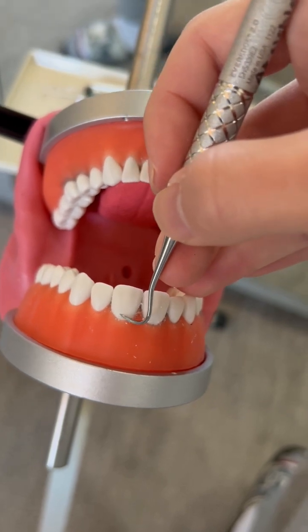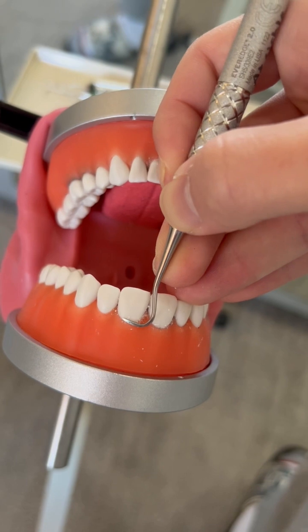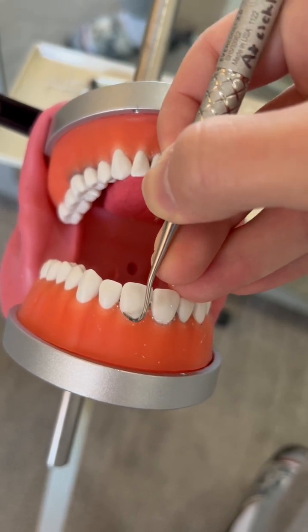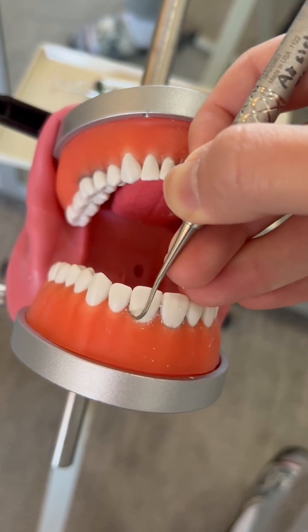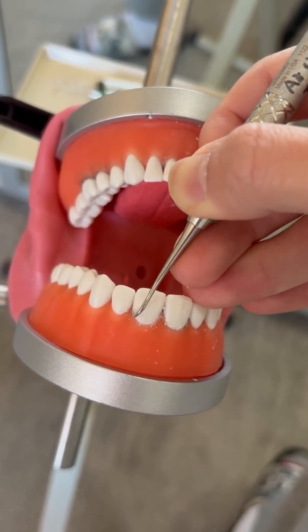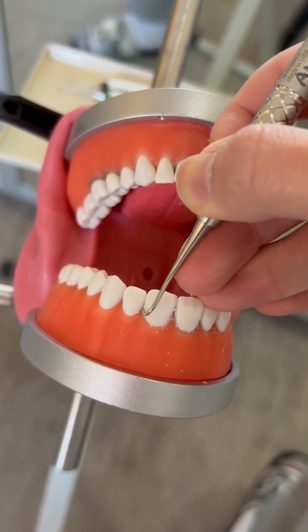Same with number 9. Start at the midline, side to side, pivot and roll, side to side, pivot and roll, knock, knock, knock.